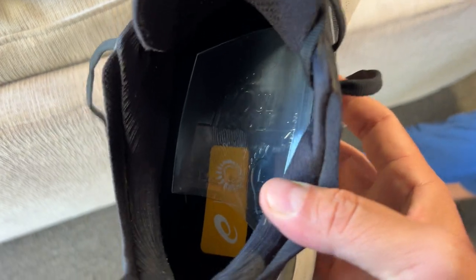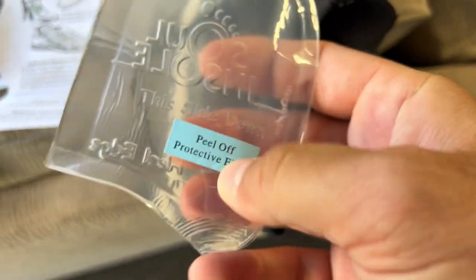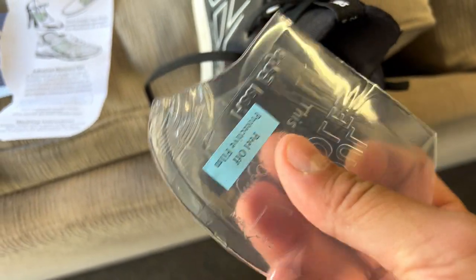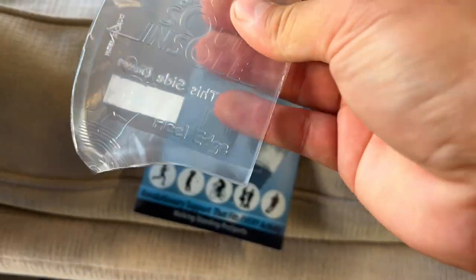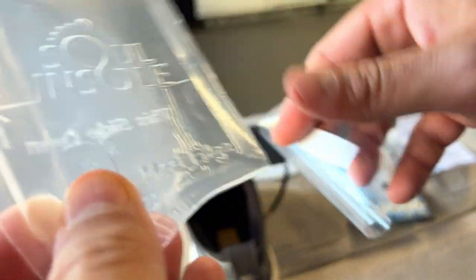Just like that, I put it inside my shoe. You're going to take off and peel off the layer, then place it sticky side down. It even shows you which one is the left foot and which one is the right foot. All you do is peel this off, and you'll see it says 'right foot.'